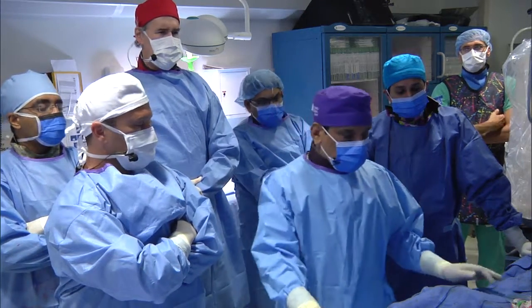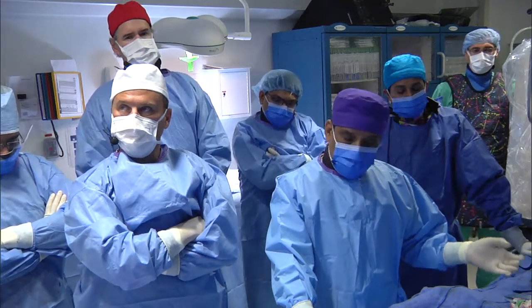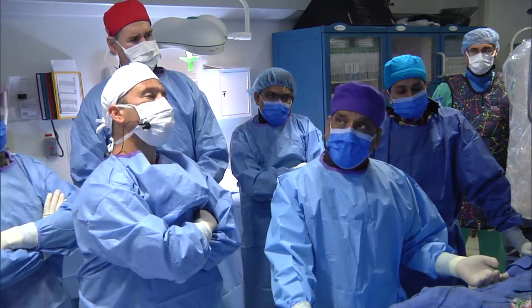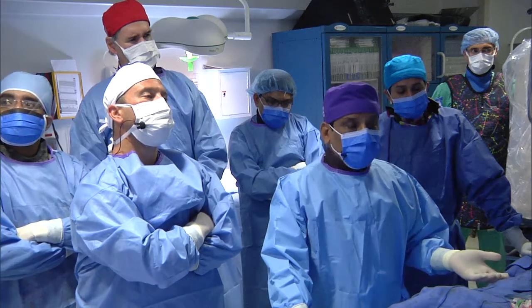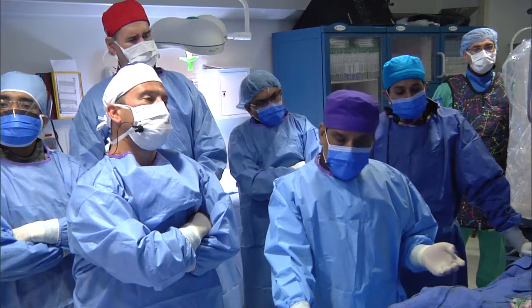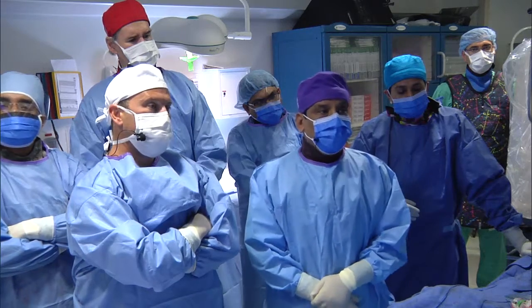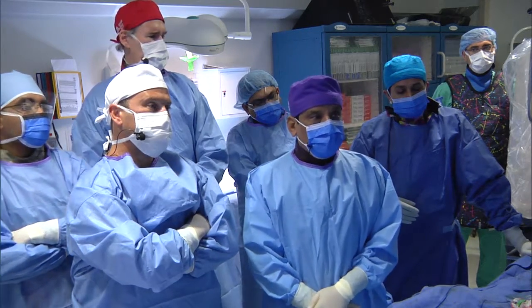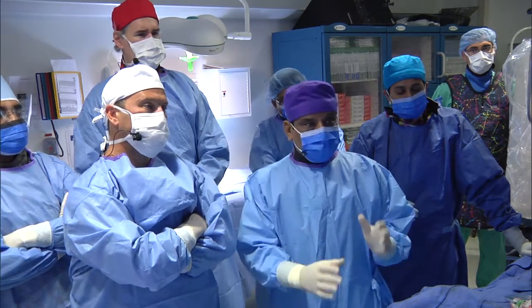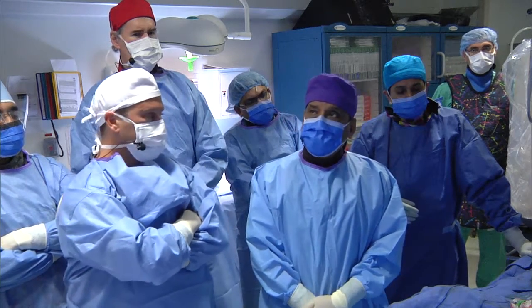Okay, so I think all these questions will continue to evolve, because valvuloplasty itself could be dangerous, associated with some of the CVAs, but at the same time it's essential for your valve to get across. And then maybe by doing a preemptive balloon valvuloplasty before you put a TAVR, you'll decrease the post dilatation. The post-TAVR BAV is the one which to me is always a concern, if by any technique you can avoid that, because that has been associated with additional complications besides just annulus rupture in rare cases, and the higher CVA rate. So with that note, let's continue our slide presentation.